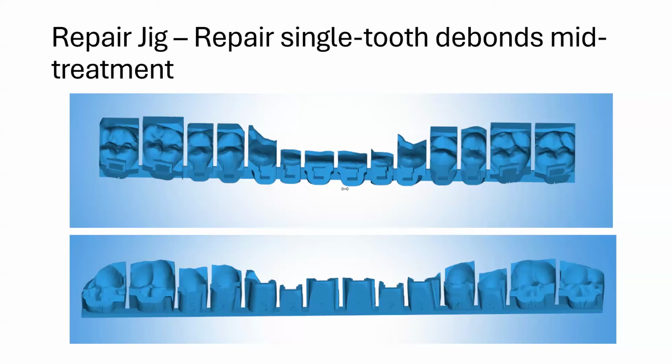Okay, let's see. Maybe Brandon, you understand this. How efficient is the setup for OGS cases? Is it just like setting up a regular braces case? What's an OGS? I'm not sure what that is. Is that a pano maybe, a different term for a Panorex X-ray? That's a great question. I don't know. Anyone else have a way? Orthodontic surgery case. Oh, a surgical case.